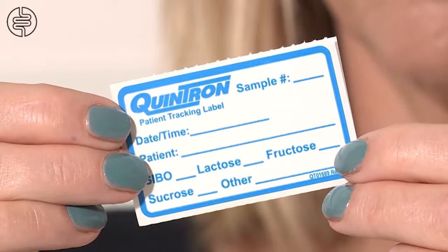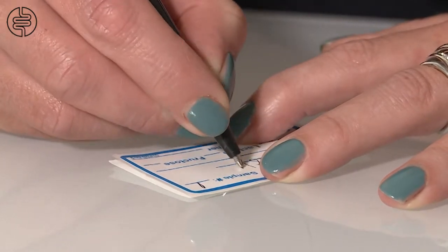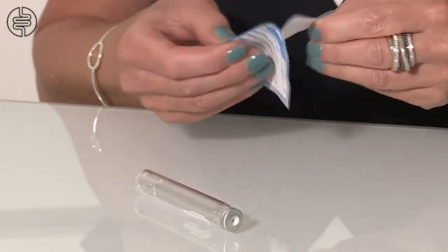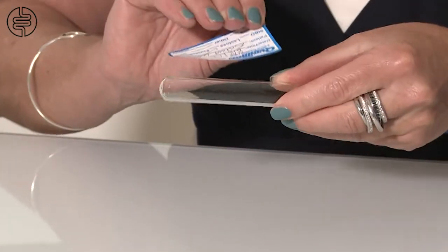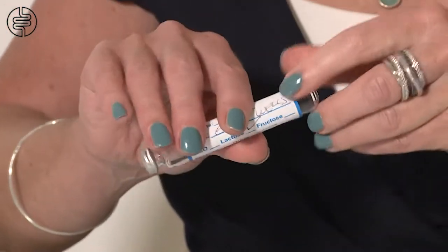Complete the first of your 10 labels. Fill in your name, date, time of collection and sample number. Please attach the label to the tube straight away to avoid confusion. Also fill in your sample time and report any symptoms on the breath tracker symptom document, and set the tube aside.